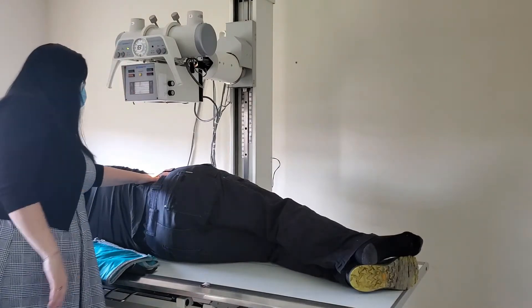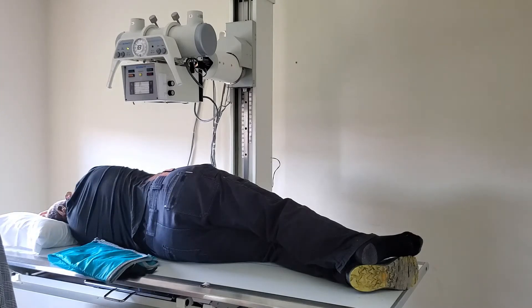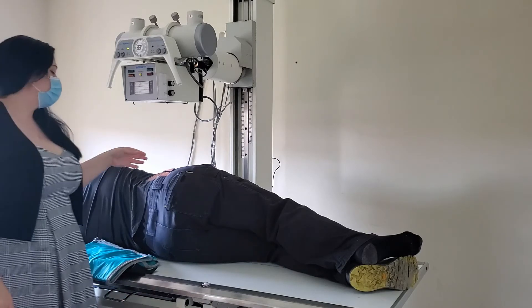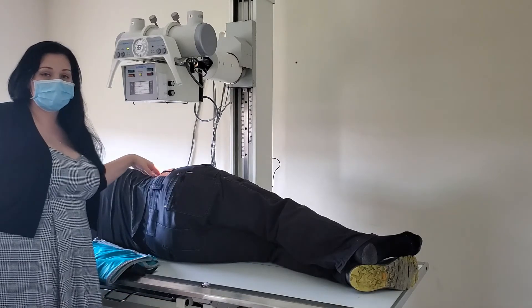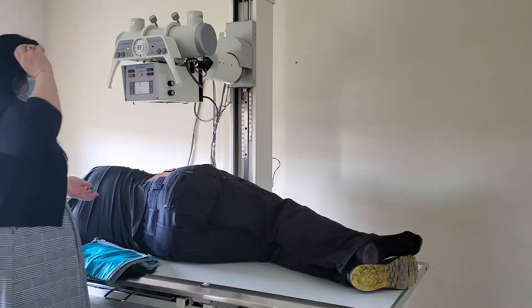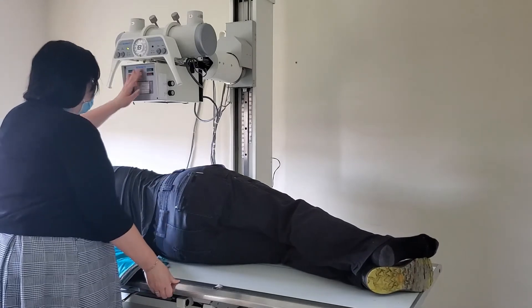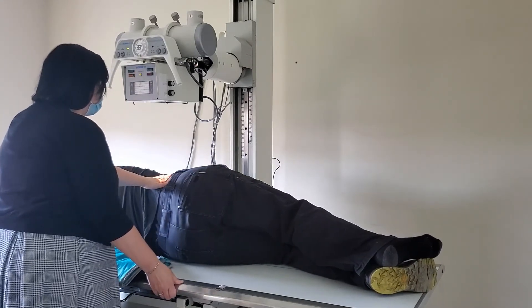That technique is correct for your standard positioning, so you can perform it in lab. Typically though, in the real world, we do employ a small angle. Merrill's states you can use a five to eight degree caudal angle. In practice, we typically just use the five degree angle. I'm going to bring it back to the lateral position at the level of the iliac crest.